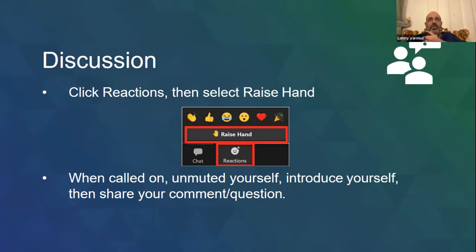So what we do is first drop is put on a slide, and we use that for the rapid analysis. And then we use the stylet and push out the remaining sample onto that filter paper, and then repeat the pass and continue doing that. Typically 4 to 5 passes will give a clot of that size. That is then put in formalin and analyzed from there.